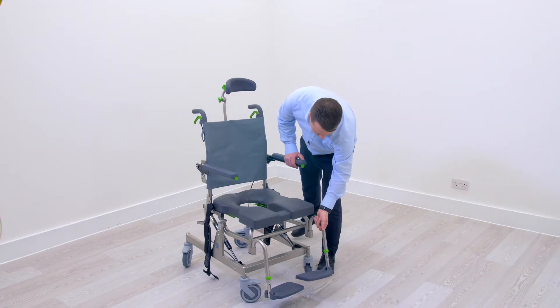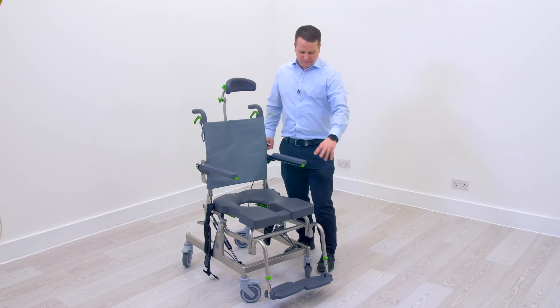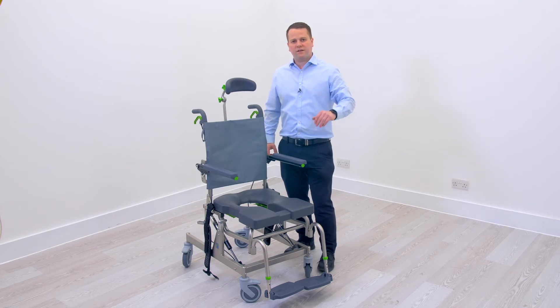To have this correct, generally the knee will be at 90 degrees and the femur, or the thigh, will be horizontal on the seat.